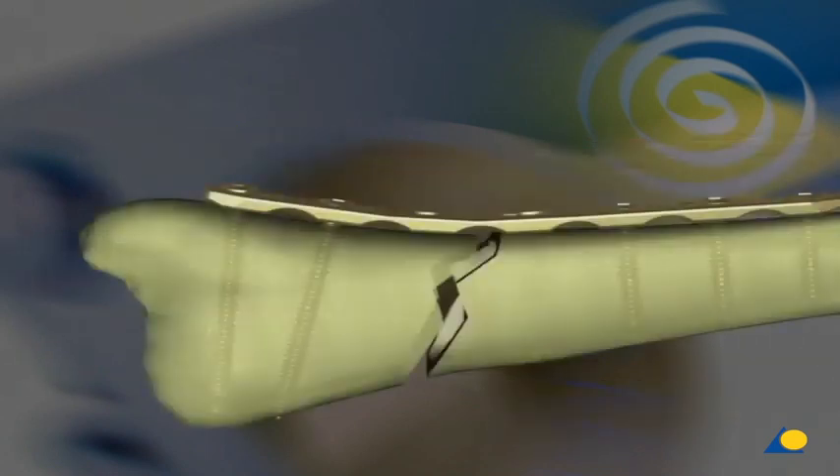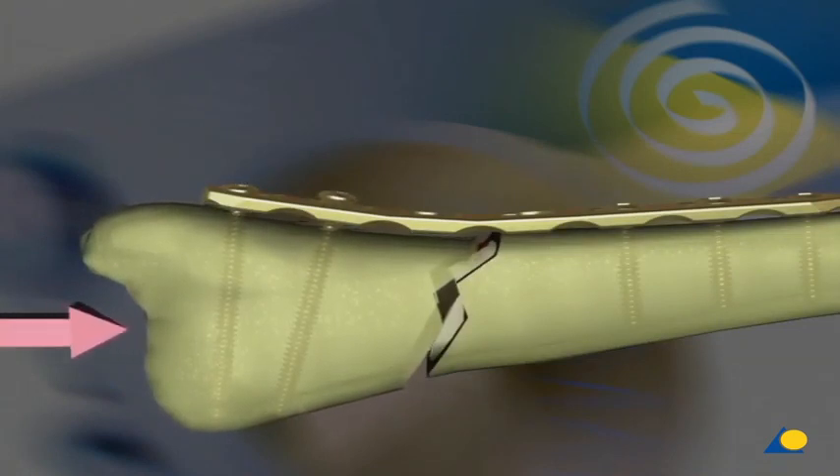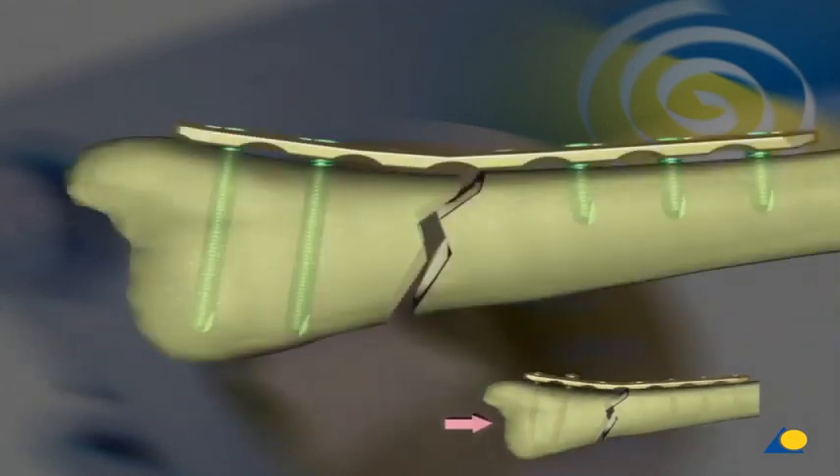In osteoporotic bone, the screws are inadequately anchored and can loosen under cyclic loading, which also means loss of reduction. The stable connection between the locking head screws and the plate can prevent this from happening.